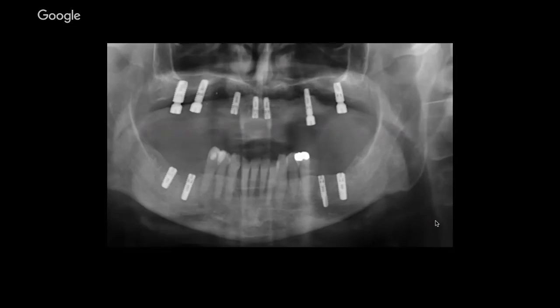I want to show you a case, a full mouth case. This case was not done in our faculty. The patient has 7 implants in the upper jaw, but unfortunately none of them obeys the rules of facial aesthetics. The patient was not asked what she wanted. The patient wanted a removable denture that was easy to clean and a nice smile aesthetic. As a result, patient-doctor trust relations were harmed.